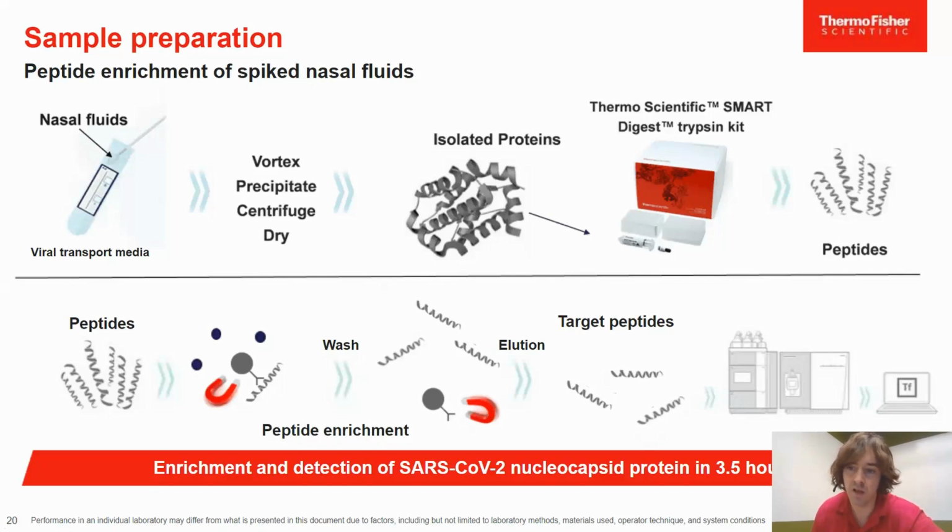and the ultra-pure sample containing the target peptides is examined by LCMS. The addition of this workflow increased the time of sample preparation by around 90 minutes, but resulted in the removal of the majority of non-targeted peptides, trypsin, and other sample components. It also had the added benefit of concentrating our samples by approximately 40-fold compared with the previous method.